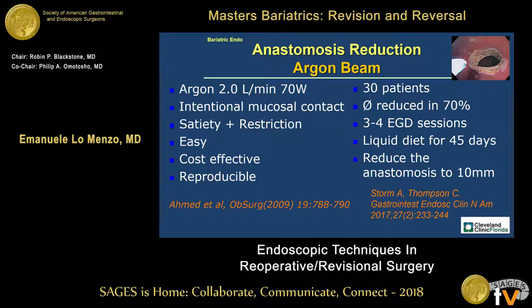What about using the argon beam to obtain the same goal of reducing the anastomosis? In this case, we intentionally touch the mucosa with the argon beam — something we tend not to do normally — but the idea is to induce scarring deep inside. It's cost-effective and reproducible, and in the small series of patients we have, it seems safe and well-tolerated. The goal is to reduce anastomoses that are approximately 10 millimeters.